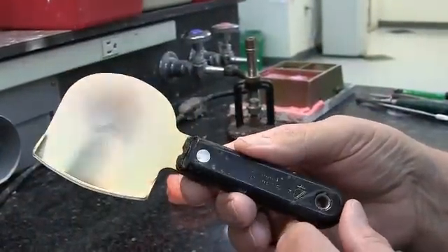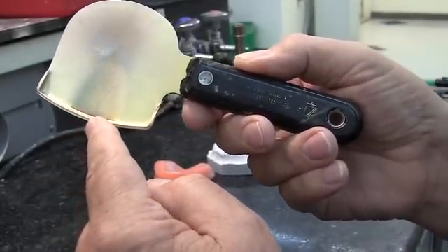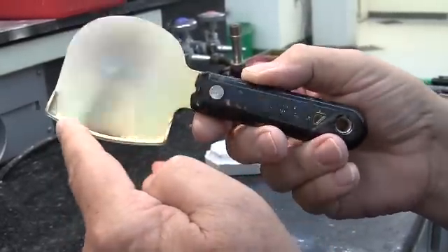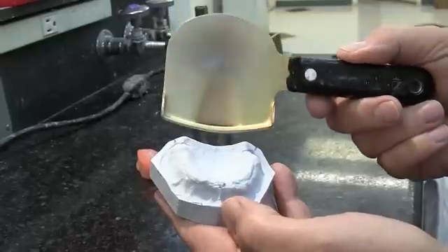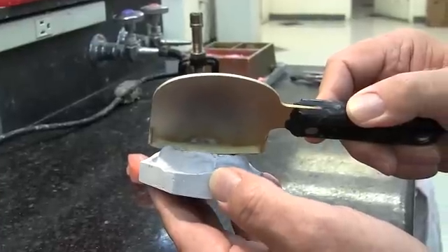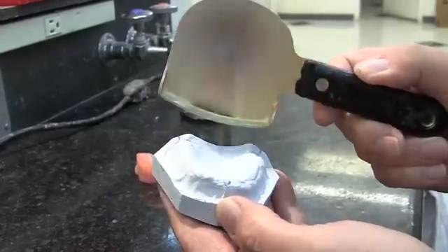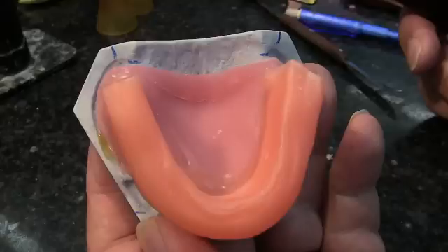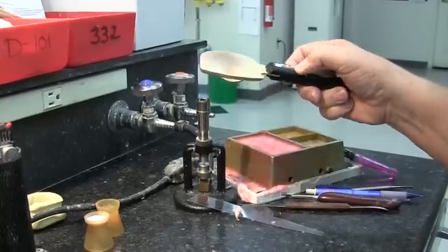We're now going to use what's called a rim former, available from Blue Dolphin Products. This has a ledge on it that will be placed on the Hamular notches, allowing us to make our occlusion rim level horizontally, left to right. We left our baseplate just slightly short in the Hamular notch area so we could see that. We'll heat the rim former up, place the ledge on the Hamular notch, and pull it down until we get our height of 22 millimeters.